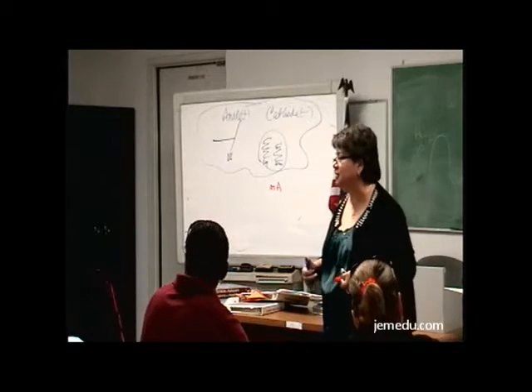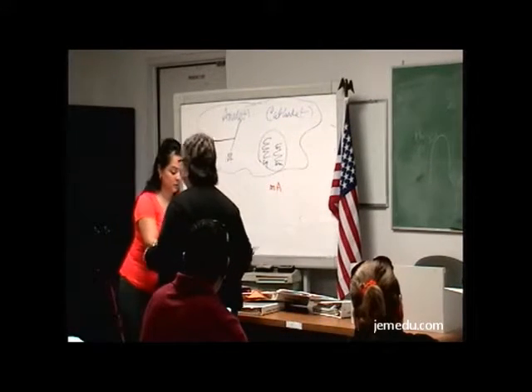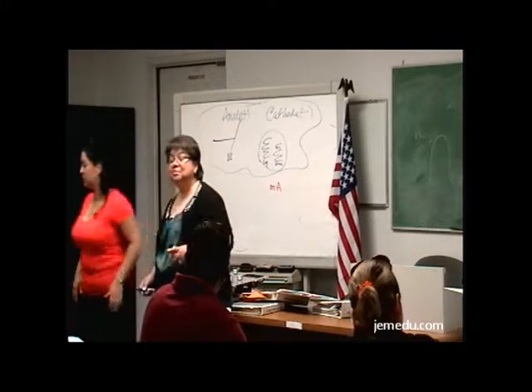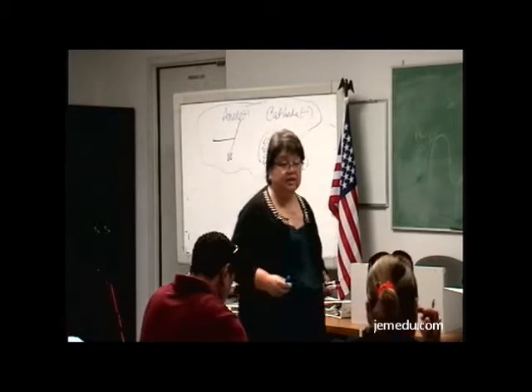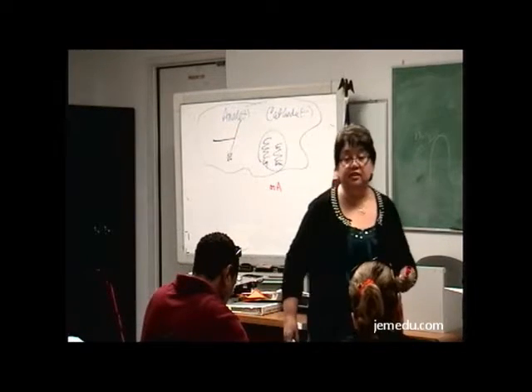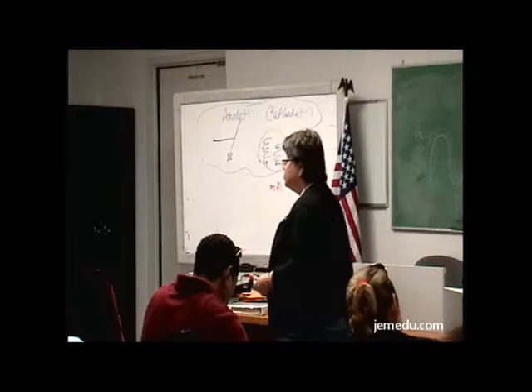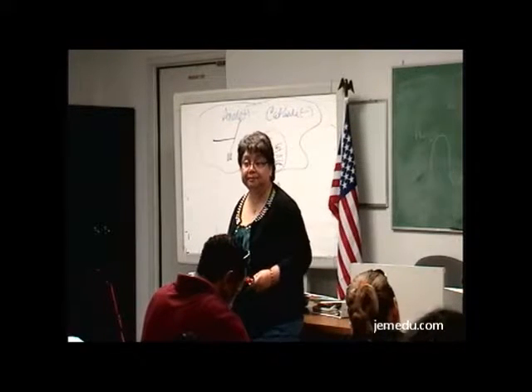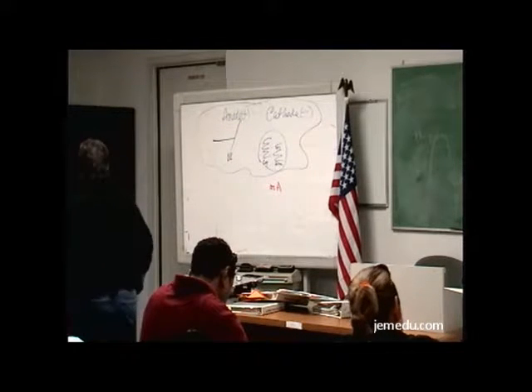Some of you, your moms, I know you young people don't have any idea what that means. Yes, we use Pyrex glass because it can withstand the heat. That's why we use it in our ovens and can bake it for a long period of time. But in X-ray production, that tube's going to get very hot at some point, so we need something that's going to be able to protect that.